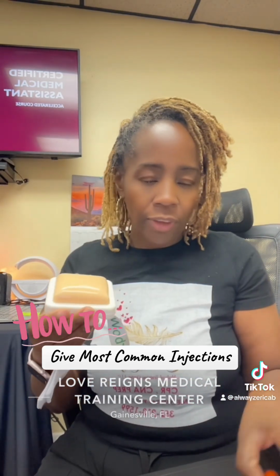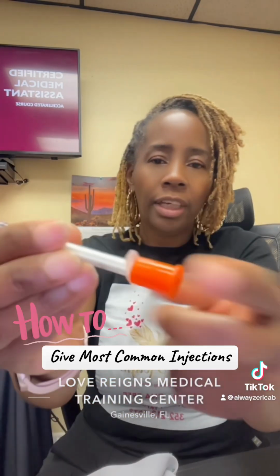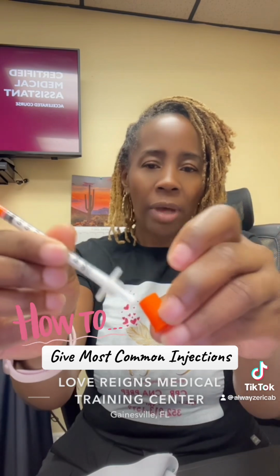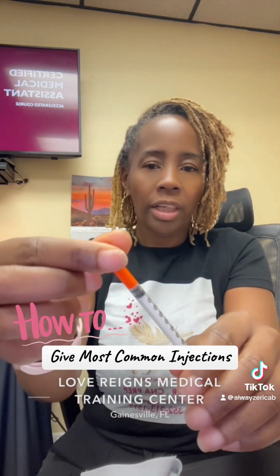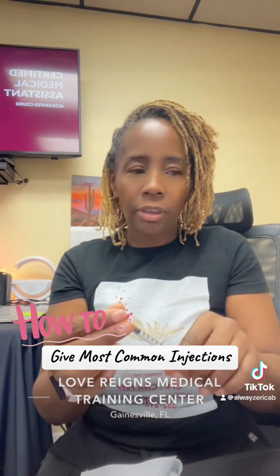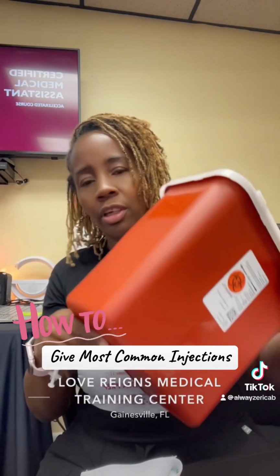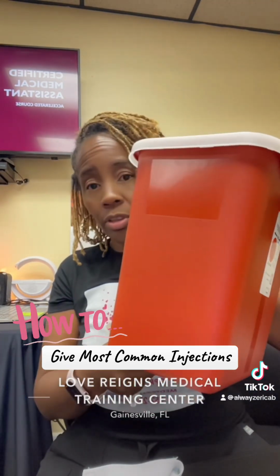Once you do that, for the most part, I just want you to know that this little thing here is the bottom. It's just a little thing that comes off, see? That's just for packaging. Once you pull that off, you'll see you have your plunger here, okay? And then that's the needle. This doesn't have a safety device on it, so when you're done, you need to put this straight into the Sharps container, okay? We call it a Sharps puncture resistant container. That may be a jug for you at your house. It could be the actual Sharps container.